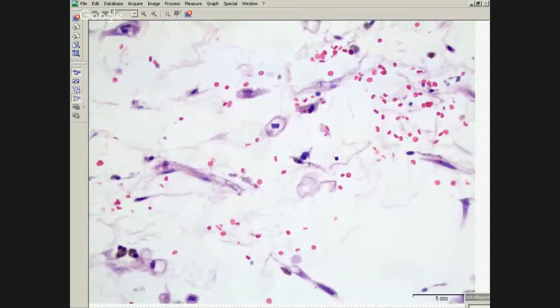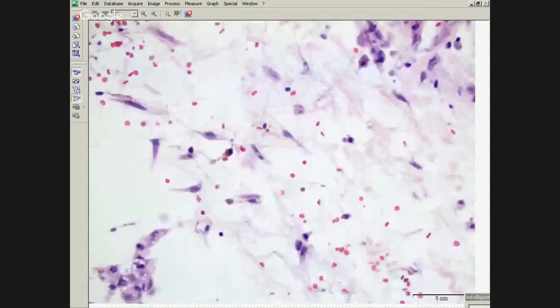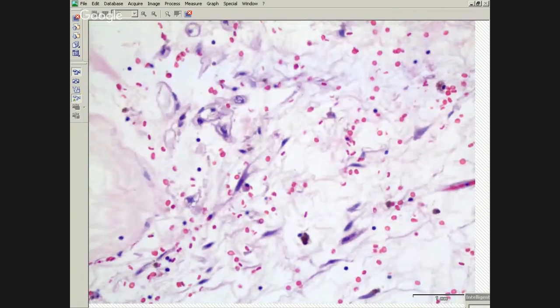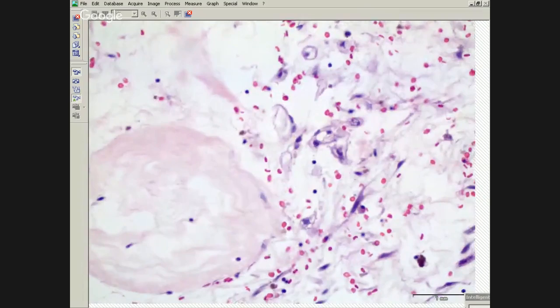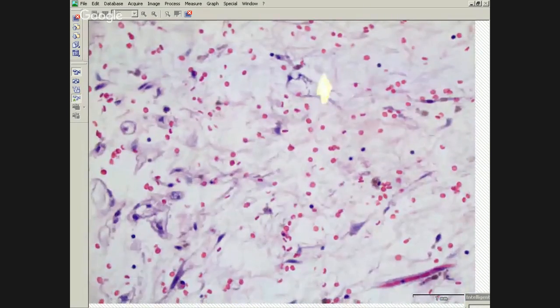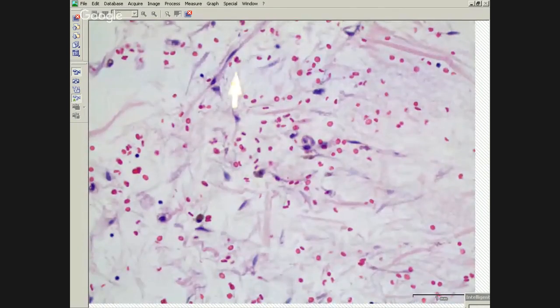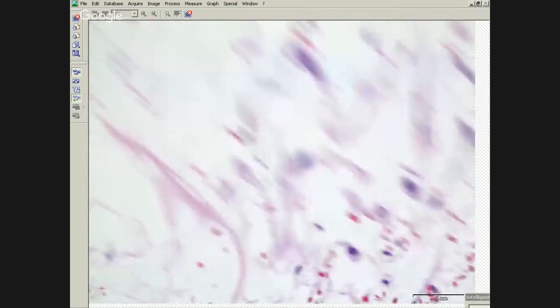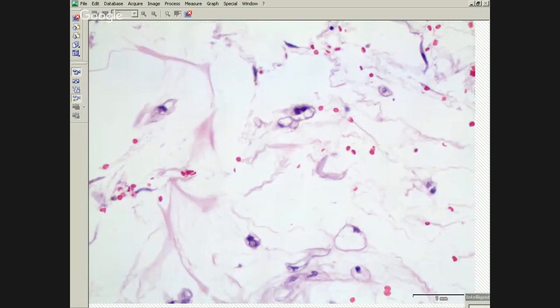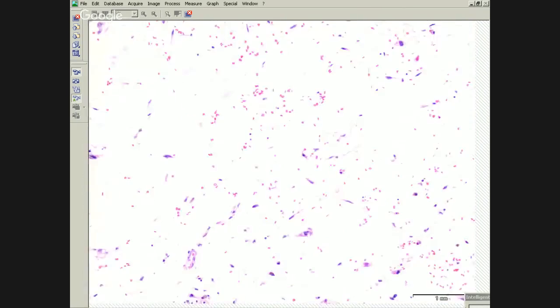And there's some pigment, it seems. Is it pigment or maybe just hemosiderin? And these cells are coming singly as well. There are some single cells and vacuolated cytoplasm. What about the vascularity? Would we describe it in any particular way? Chicken wire. Yeah, it's not the best example, but it's kind of chicken wiry.